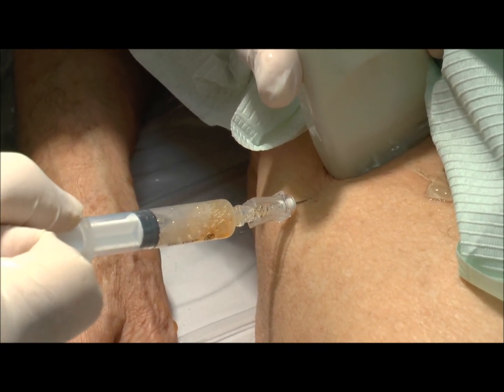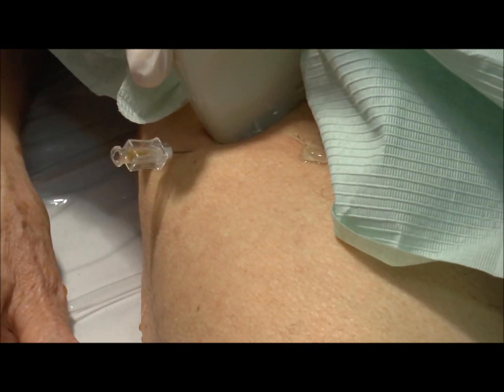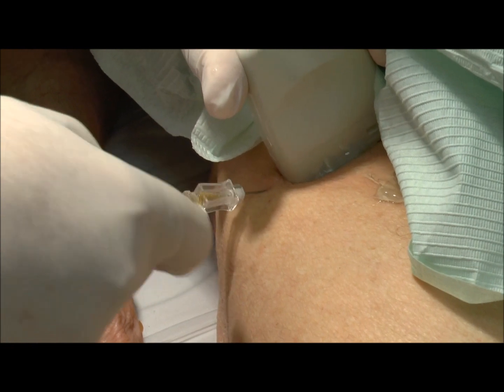This is synovial fluid, which we have just removed. And now we proceed with the local anesthetic.